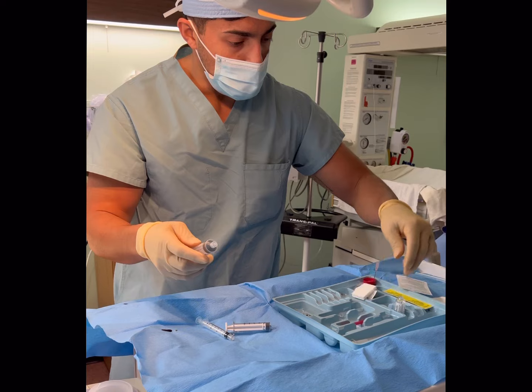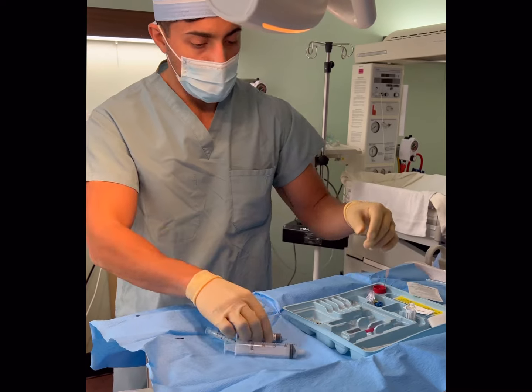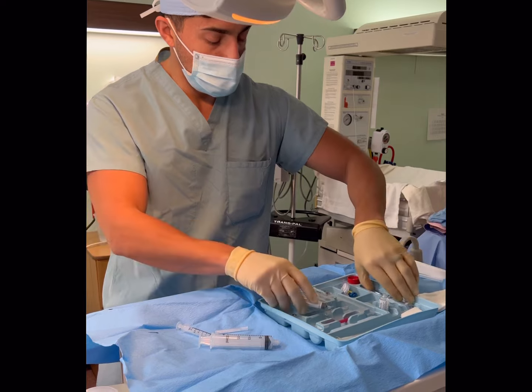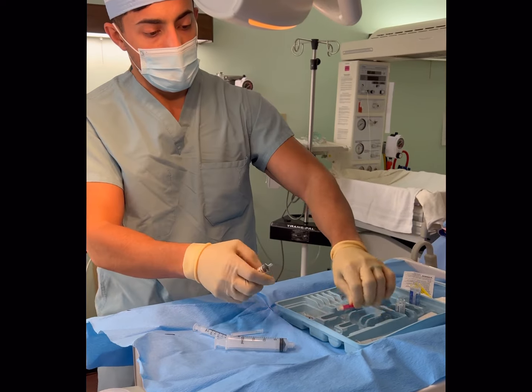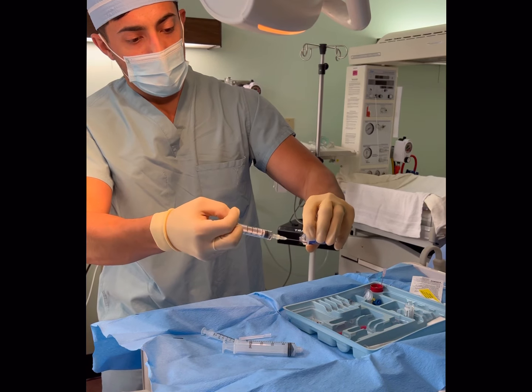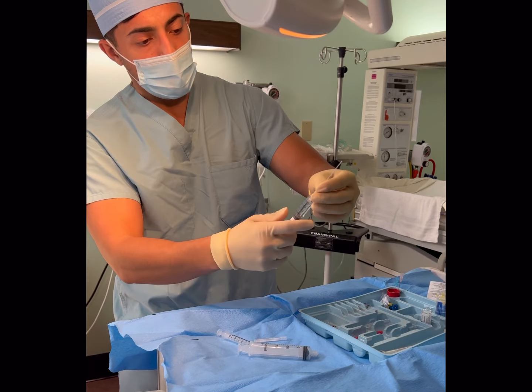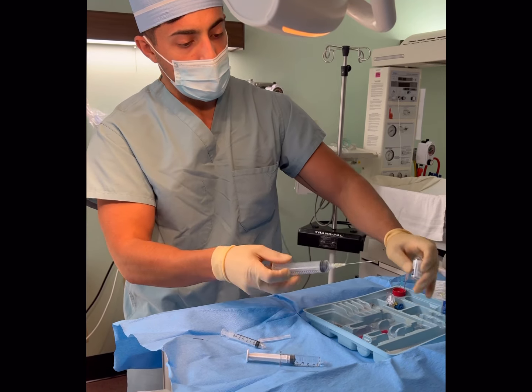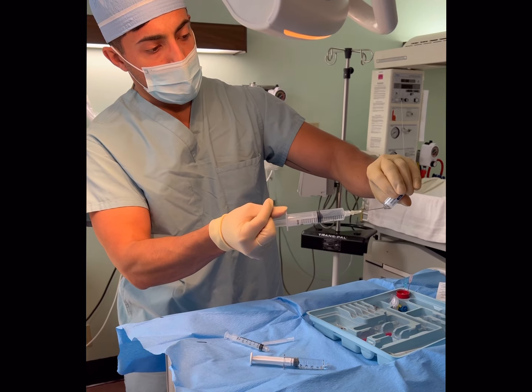It looks like this kit did not have a test dose, so I'll have to draw that up — no worries. Let me put some saline in here. This is a filter needle. I'll put some saline into my loss of resistance syringe. I like to use saline; I don't really like to use air. We'll put the leftover lidocaine in here and use that as the start of the test dose, but we'll need to add epi to make sure we're not in a vessel.